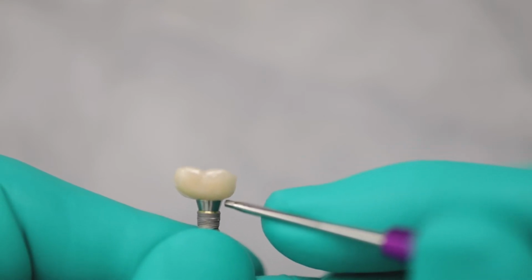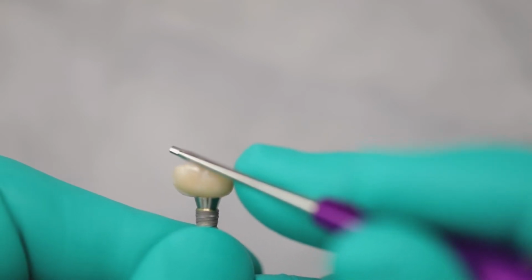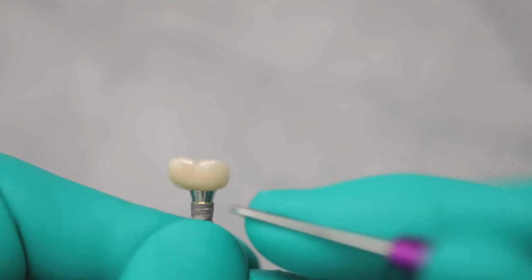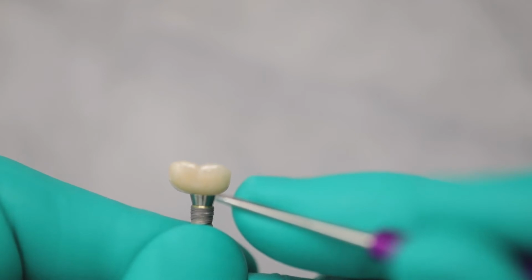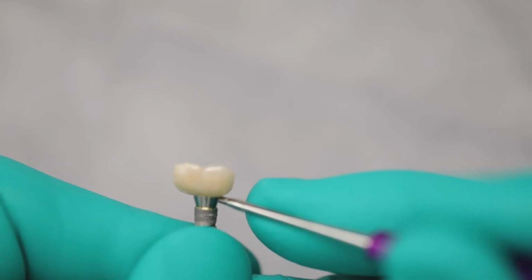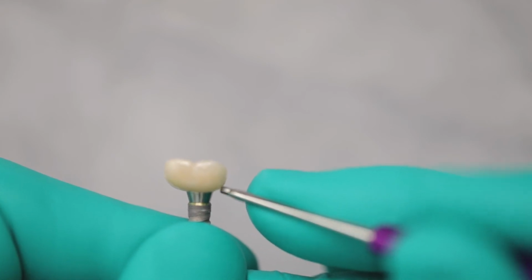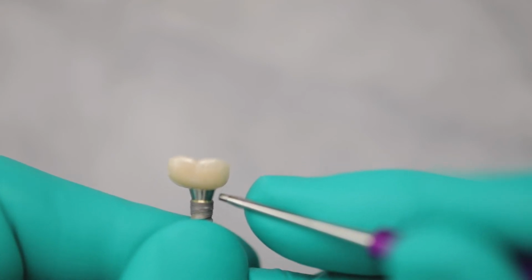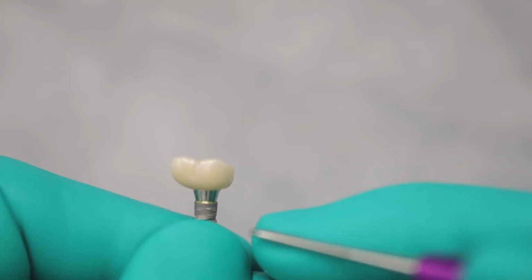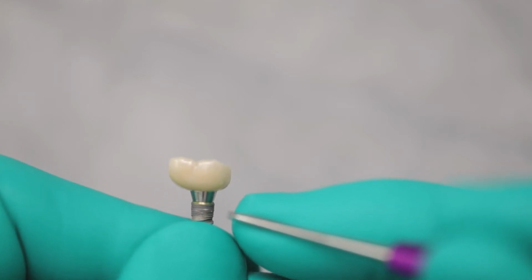There's one more aspect to the ET. When you have this angle that shoots out straight like that, if you apply forces to the margins here, either actually to the center or to the mesial or distal margins of this solution, what you'll find is that by having a steep angle, being defined as coming up and then going straight out to the side, that would be a steep angle. If we have a steep angle right here, the stresses are nearly 7 times higher. In this region right here, stresses are 7 times higher than they would be if this was filleted in and you had a heart-shaped solution. So when you see solutions that look like ETs, you also want to be very careful about working with these because they can really lead to a potential problem.